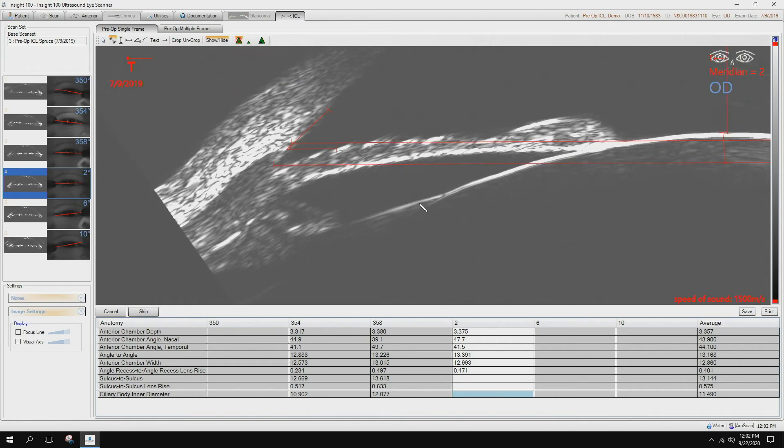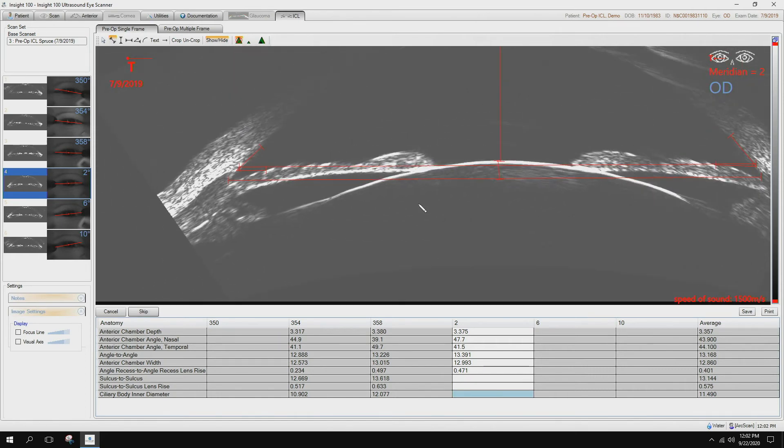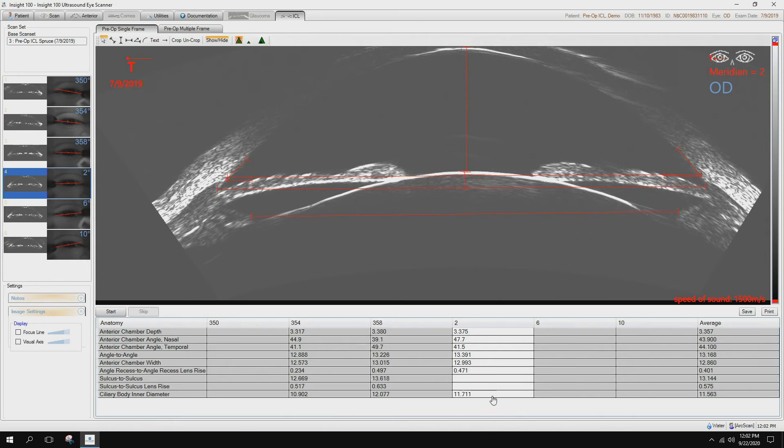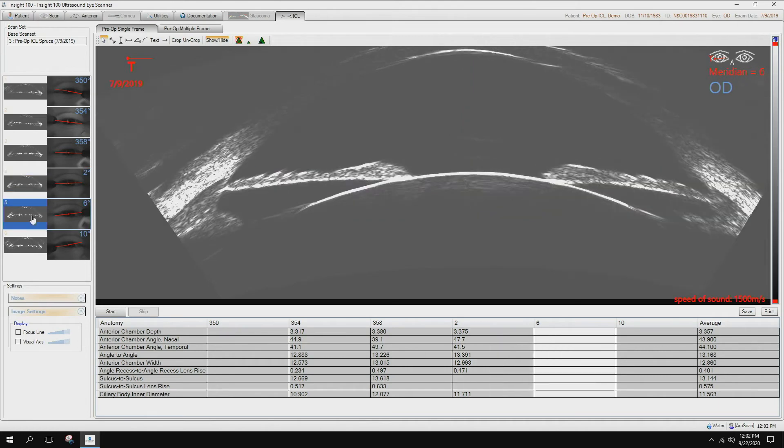Zooming back out. Now I want to do ciliary body inner diameter. So you can see it skipped those in there, but we've already got a few. That's why we want you to take a few of the various meridians that have the best imagery and that way you have an average of them.